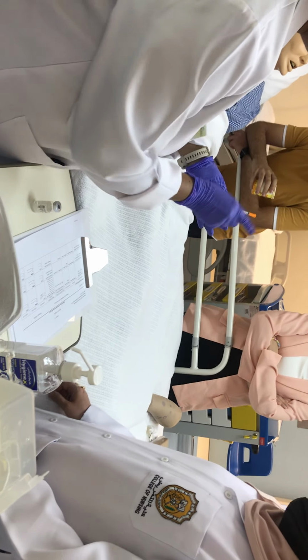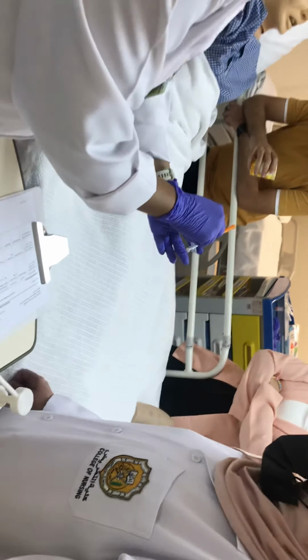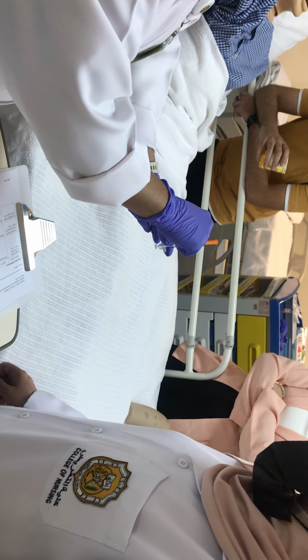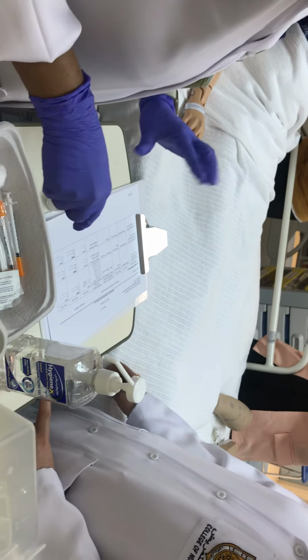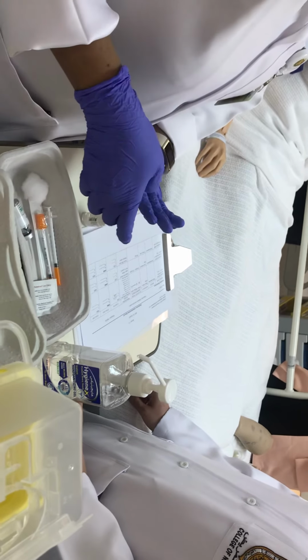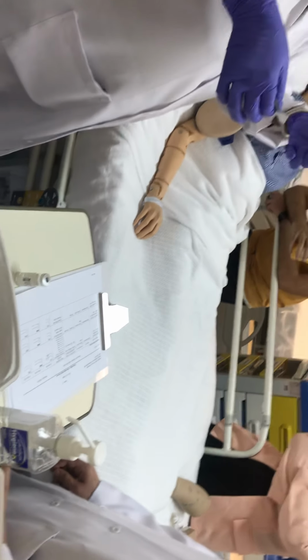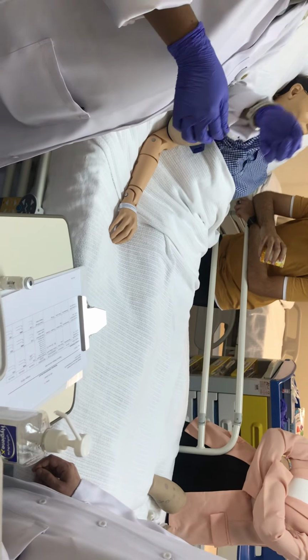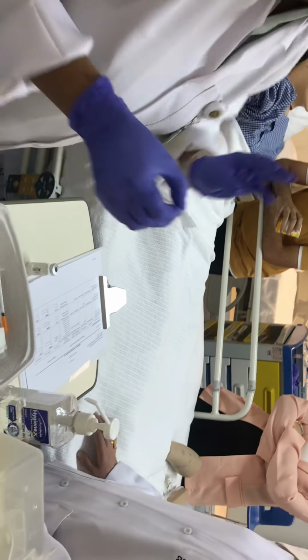So just to check whether it is functioning and for them to learn, okay, I'm going to take 10 units, so where it is. Okay, they should see all those things. Then when I want to take the medicine, I don't have time to go clean the patient. I have my syringe already in my hand. So finish all the rest of what you need to do with the patient first.